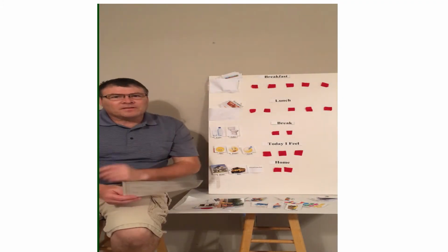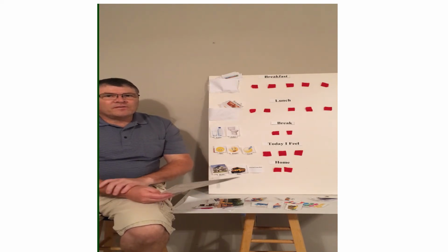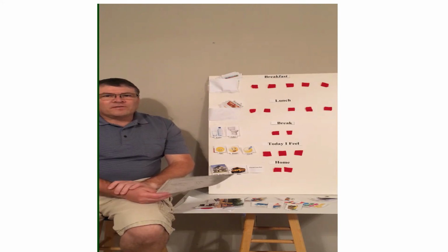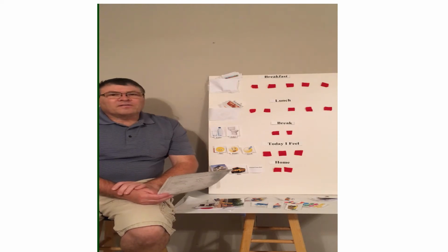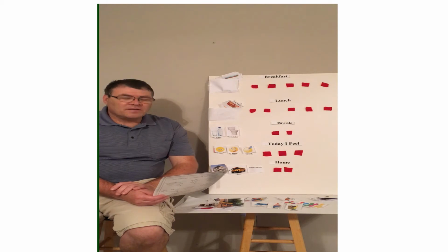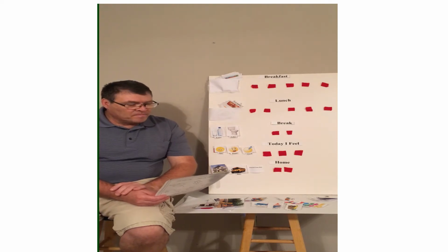Hello, my name is Dallas Essary, and this is my demonstration for my communication board for my assistive augmentative communication creation project. An augmentative communication device is a device dedicated to transmitting or producing messages or symbols in a manner that compensates for the impairment and disability of a recipient with severe expressive communication disorders and limitations.